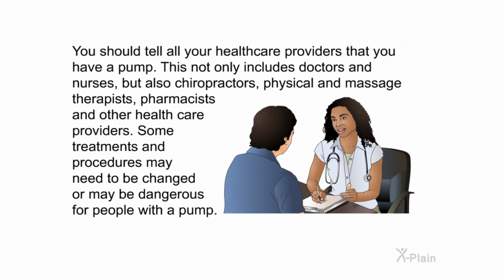You should tell all your healthcare providers that you have a pump. This not only includes doctors and nurses, but also chiropractors, physical and massage therapists, pharmacists, and other healthcare providers. Some treatments and procedures may need to be changed or may be dangerous for people with a pump.